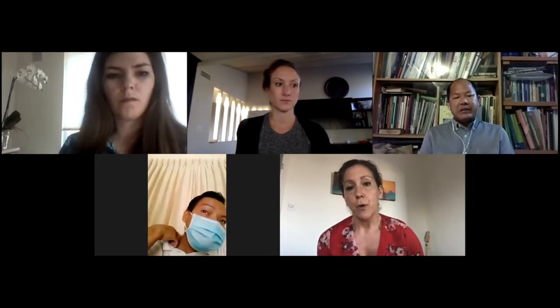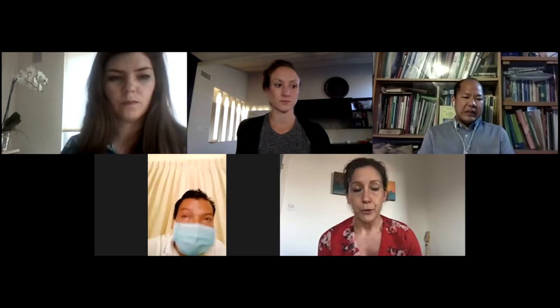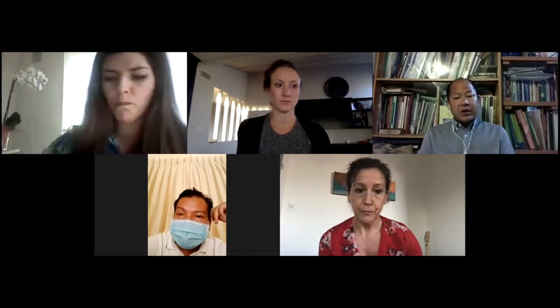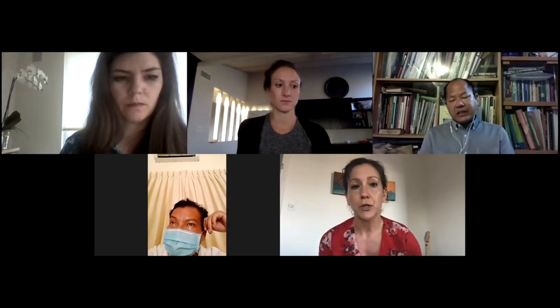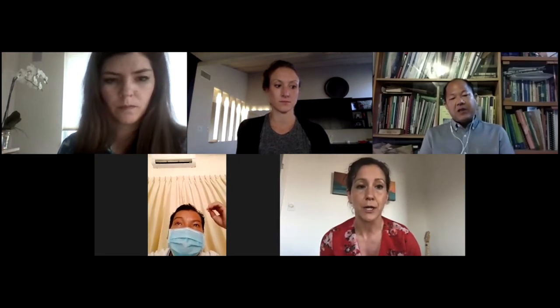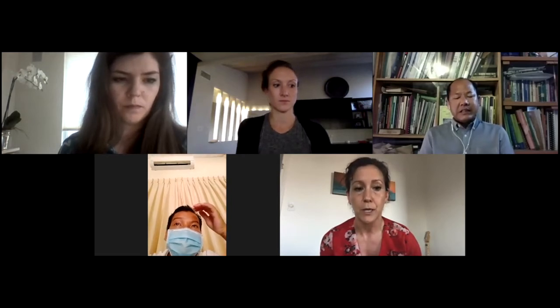So I think one important point is to realize the goal SpO2 and to deliver the right amount of oxygen. Not too little, but also not too much, because oxygen is very expensive and sometimes has limited supply. You want to make sure you're delivering the appropriate amount to each patient so that you can treat more patients and not use all the oxygen on just one patient.